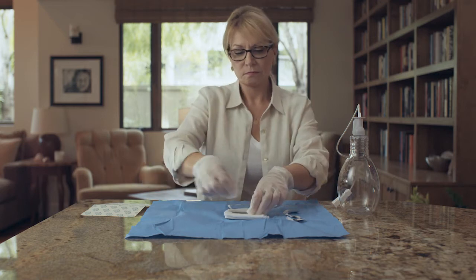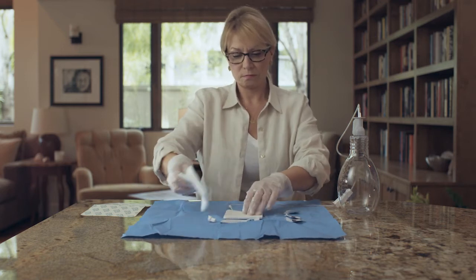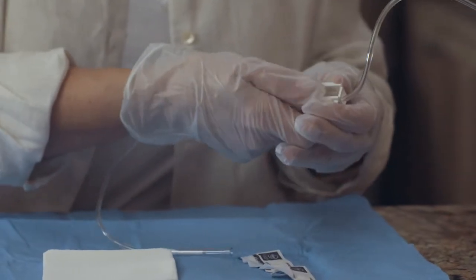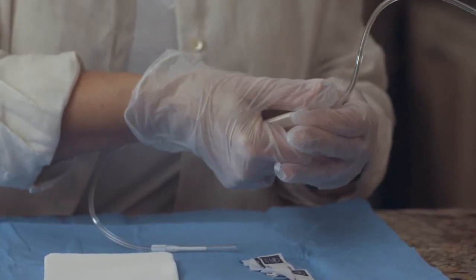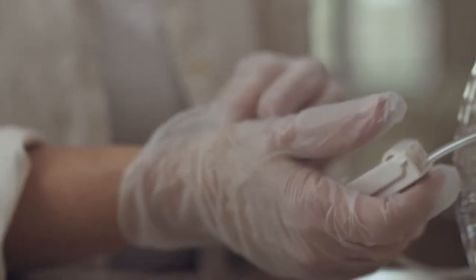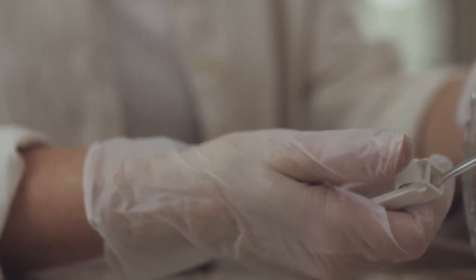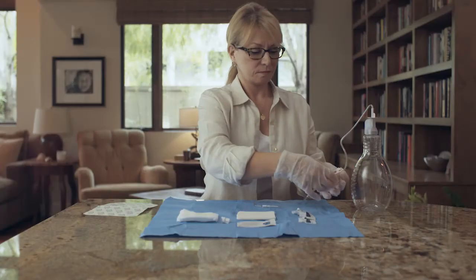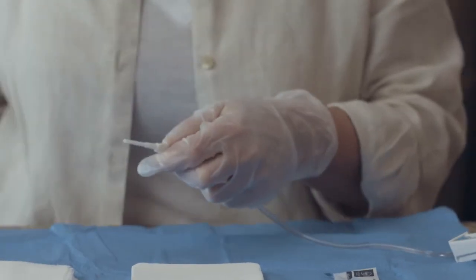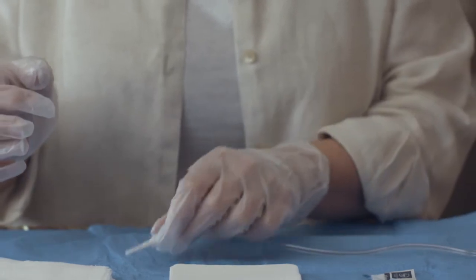You are now ready to prepare the drainage line and catheter for draining fluid. Close the roller clamp completely by rolling the wheel on the roller clamp toward the bottle. This roller clamp prevents drainage from starting until you're ready. The roller clamp on the drainage line must be completely closed when not draining or the vacuum in the bottle may be lost. Pick up the drainage line near the tip, twist the cover, and pull the cover off. Set the exposed tip back on the sterile blue wrapping.